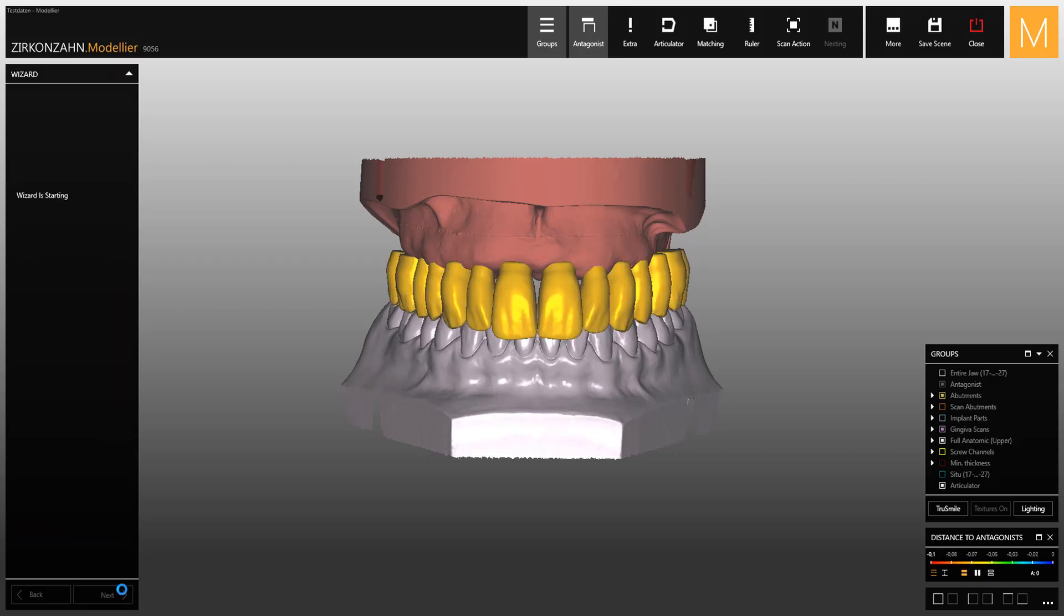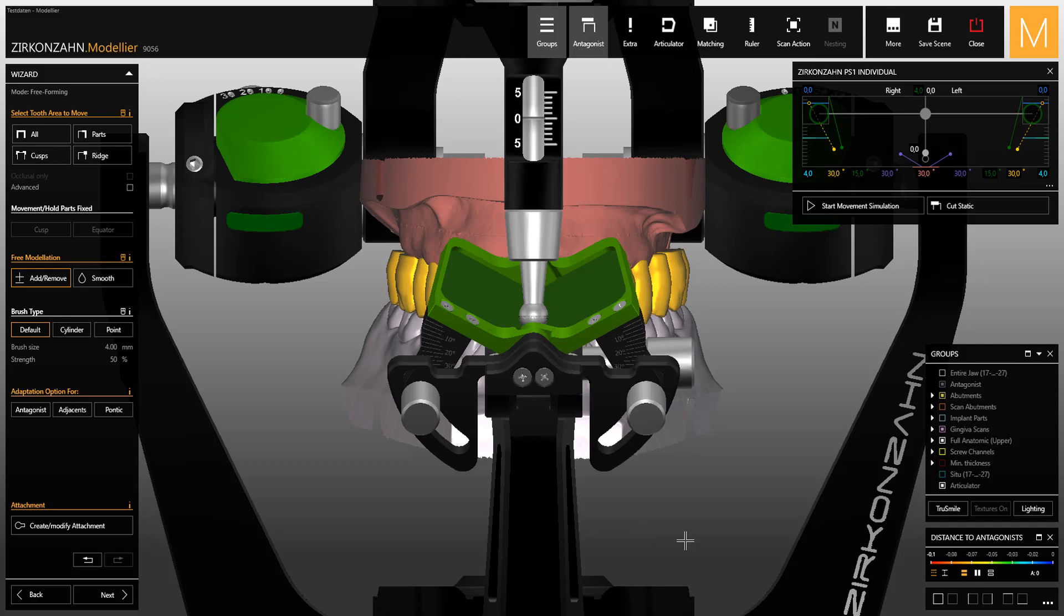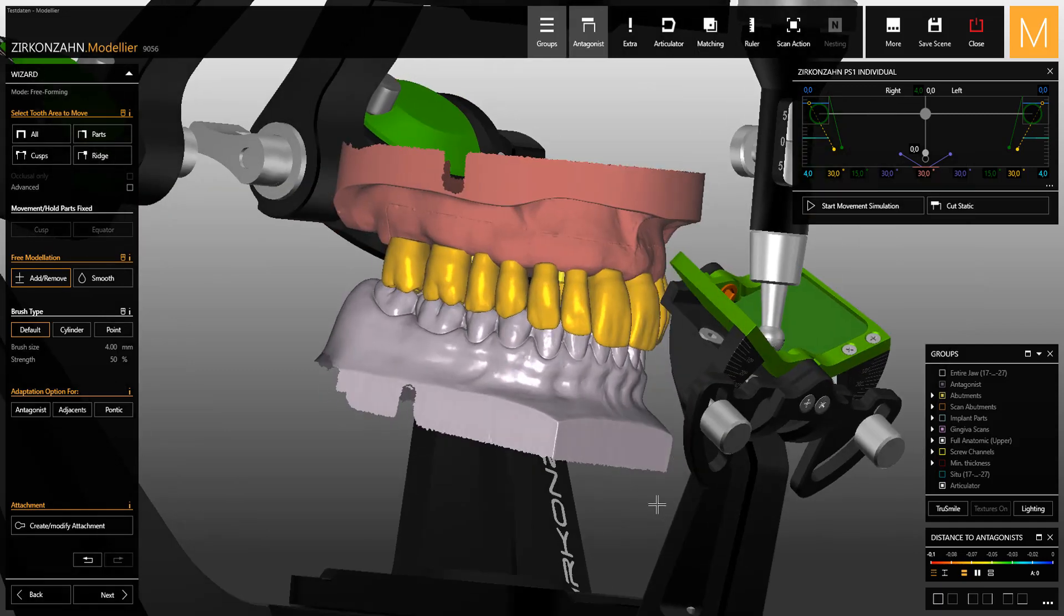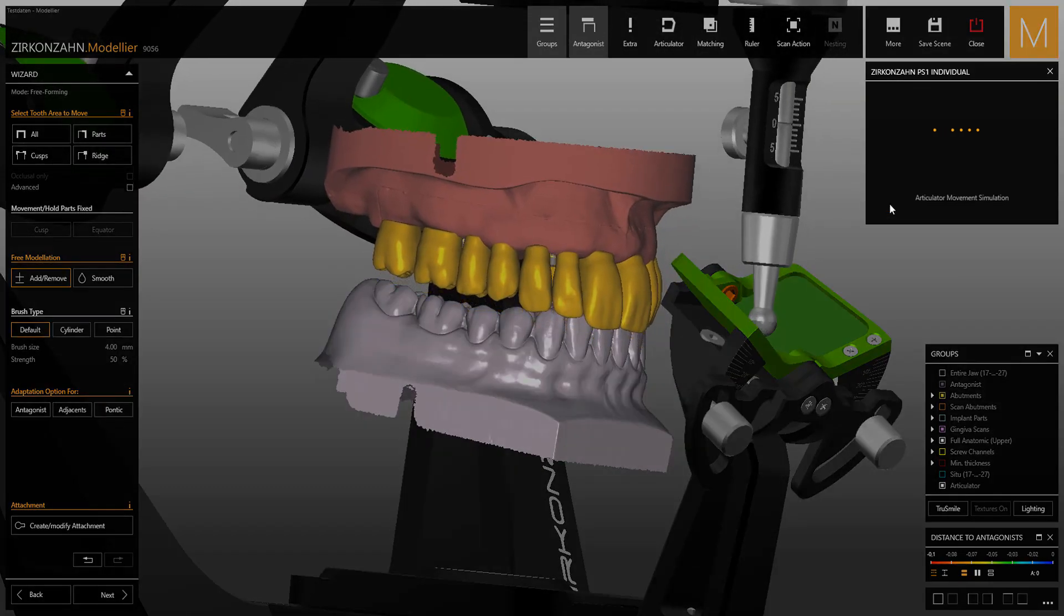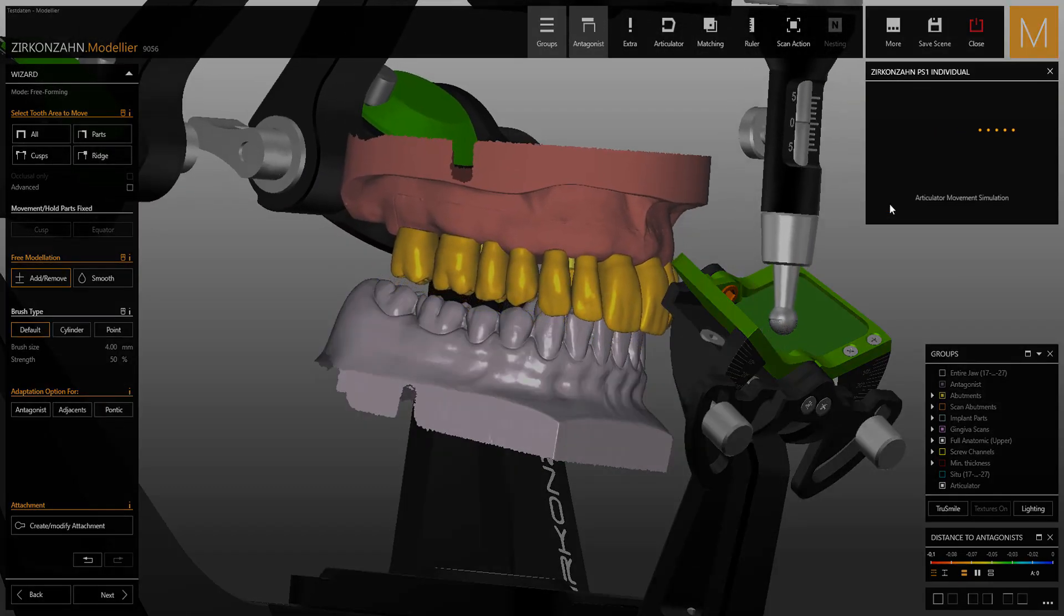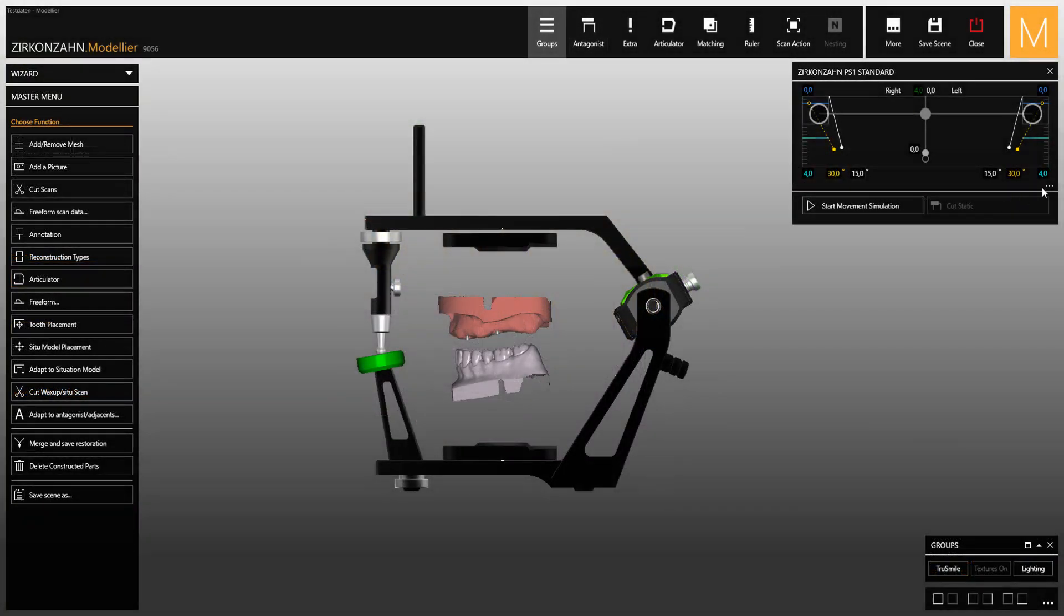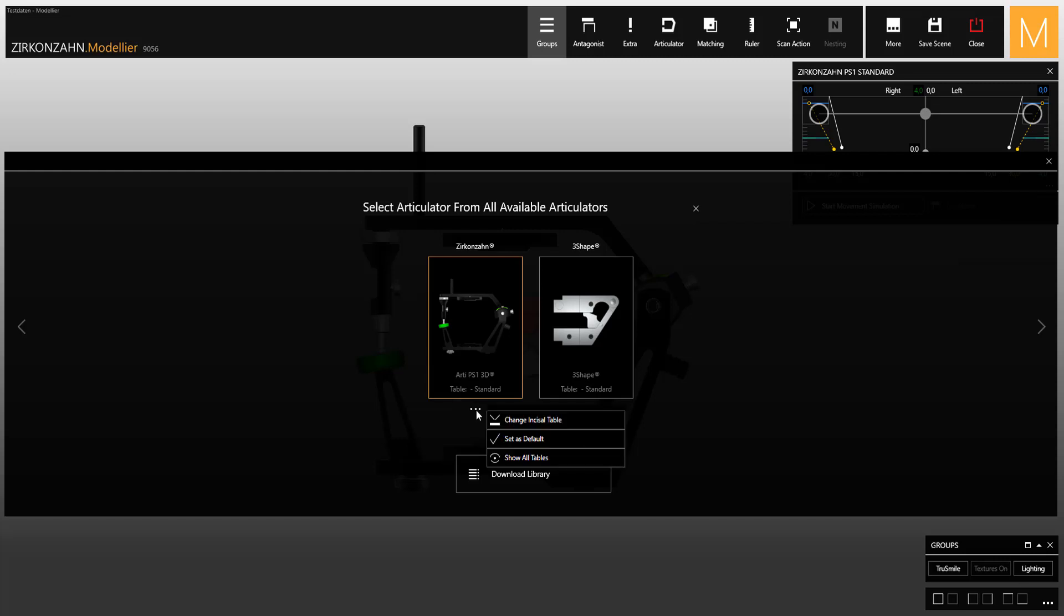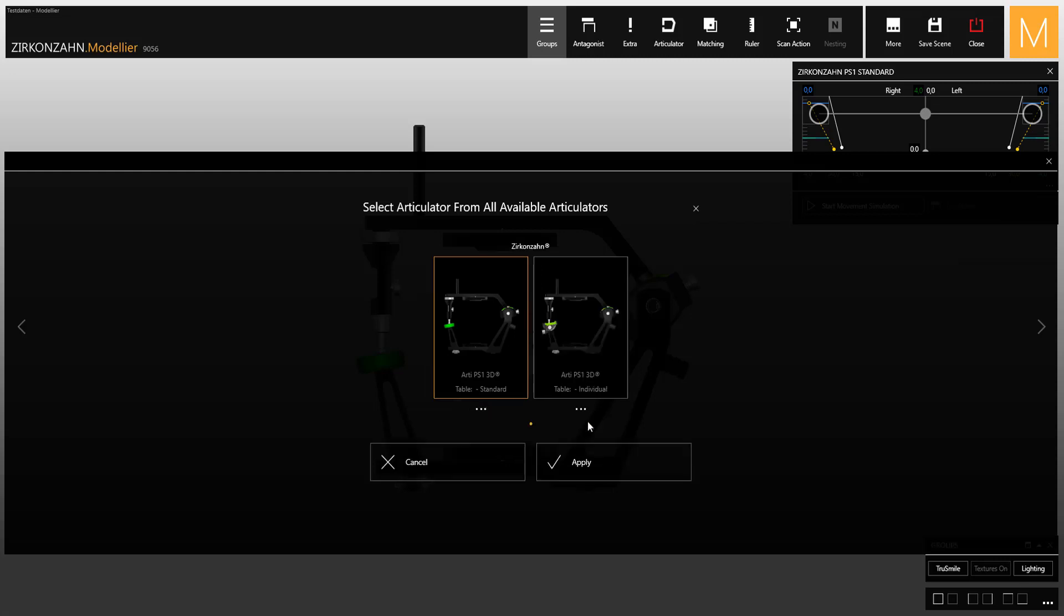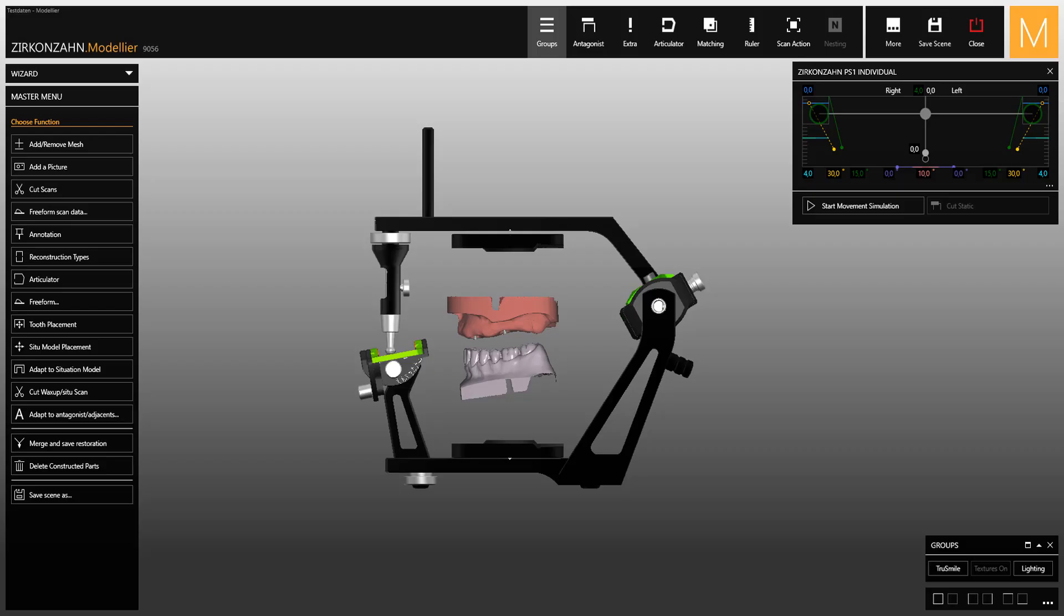To change the articulator table, click on choose articulator, then change incisal table and select the other articulator. Afterwards, set all the necessary parameters and click on start movement simulation.